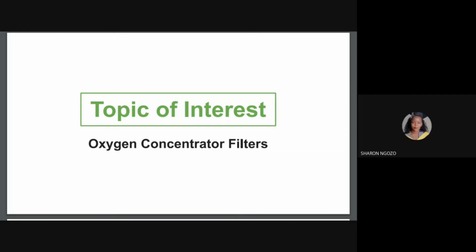Okay, from the AirSep Intensity 10 that I've come across, they have them, and I think they need to have them. So this is one of the filters that most of the concentrators that we have tried to open, they have the bacteria filter. It's something that is really important.